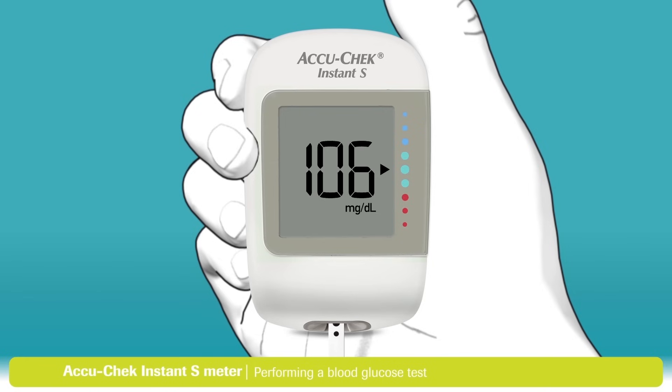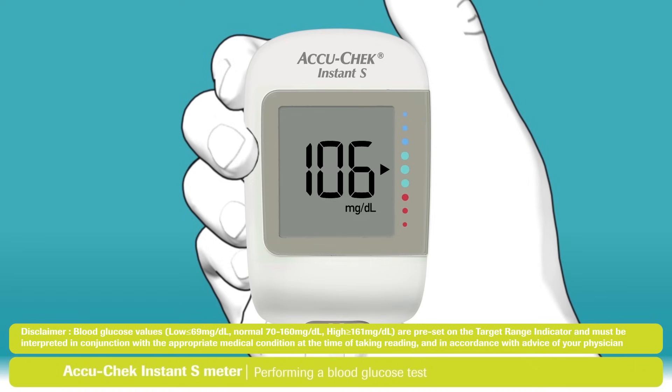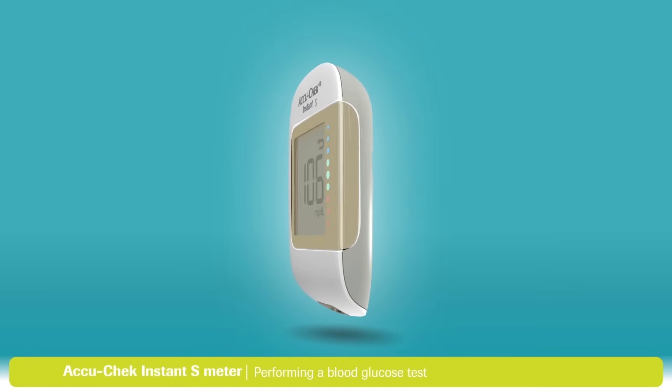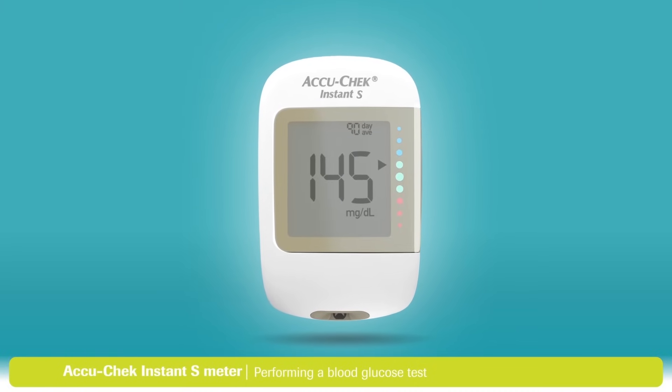It's just that easy — now you have your test result. When your test result appears, the arrow shows if your result falls above, within, or below the target range. The target range is represented by the green region of the target range indicator, and the arrow will flash if your result falls above or below this range. The target range can be individualized to meet your personal therapy goals. If you press the button, you can view your previous 7, 30, and 90-day averages on your display.